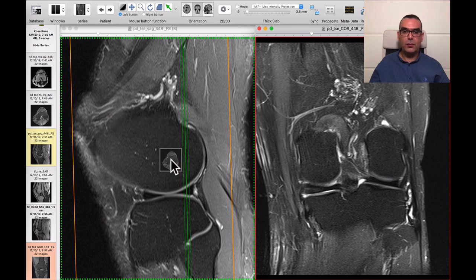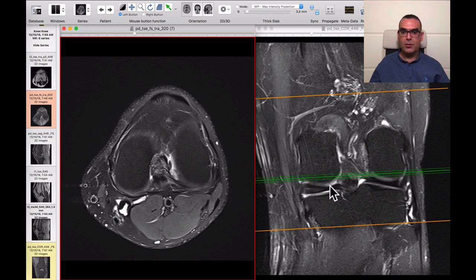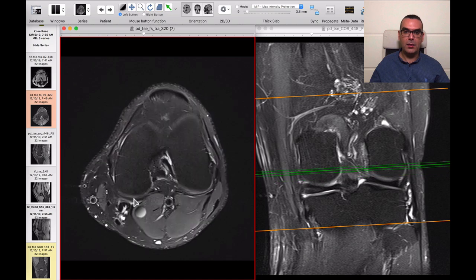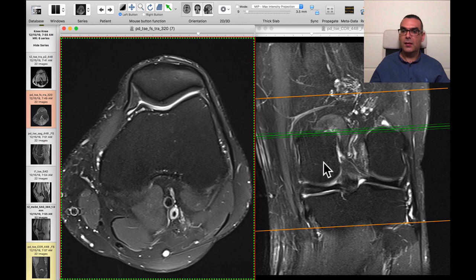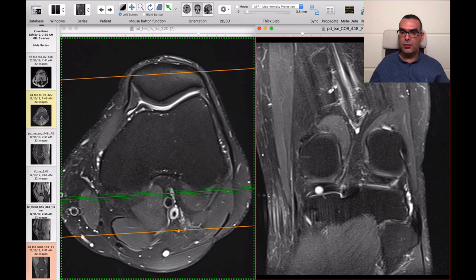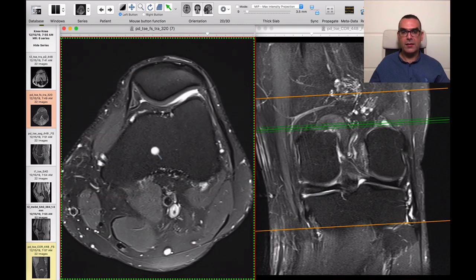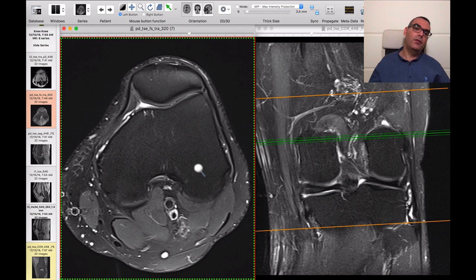Let's identify the posterior oblique ligament at the posteromedial corner. Just above the joint space we can see the medial collateral ligament fibers and the fibers of the posterior oblique ligament at the posteromedial corner. So we now know this is just mild degeneration of the posterior horn of the medial meniscus with minimal joint effusion — articular cartilage is intact, everything else is intact.